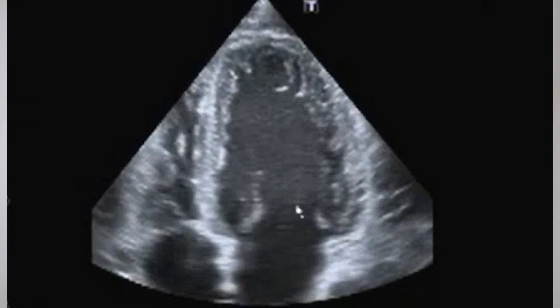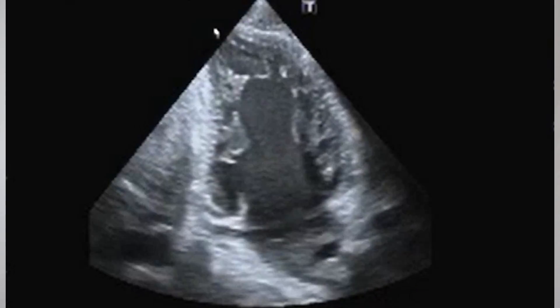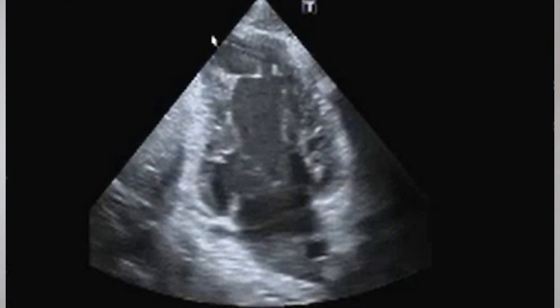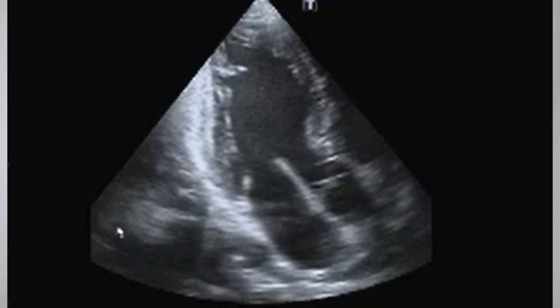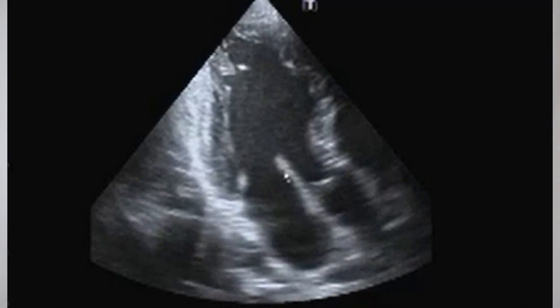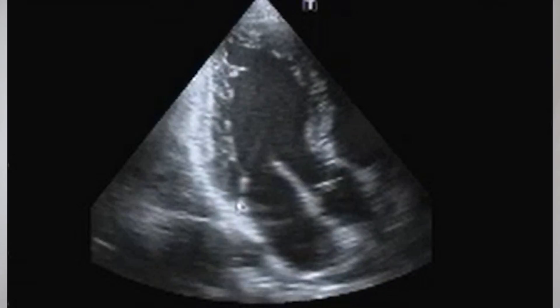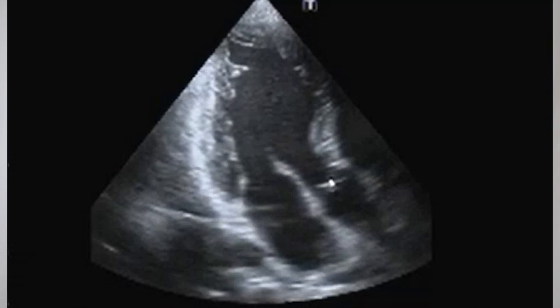I then tilt my probe slightly to change the angle and be able to assess the aortic valve. I then tilt my transducer to get the apical two-chamber view, in which only the left ventricle and the left atrium are displayed. Then I tilt my probe to see the apical three-chamber view, which shows the left atrium, the anterior mitral valve leaflet, the posterior mitral valve leaflet, the aortic valve, and the left ventricle with its different walls.